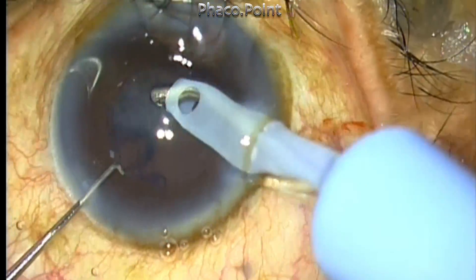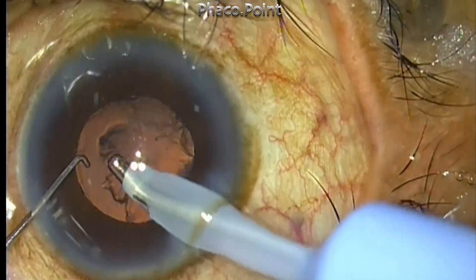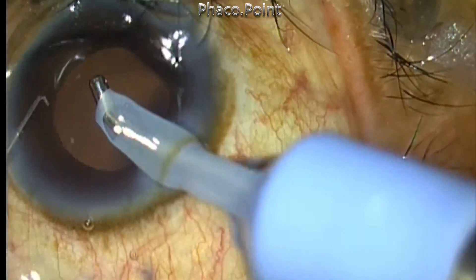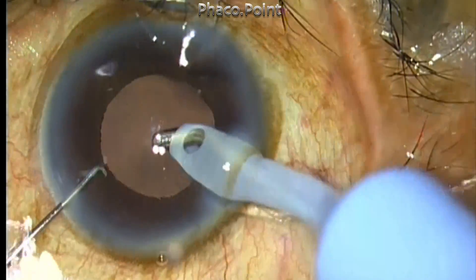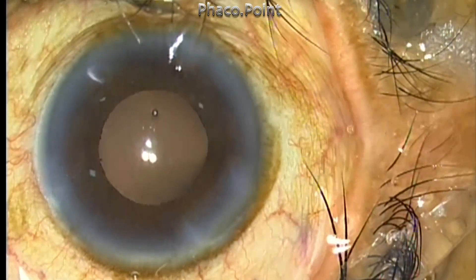During cortical aspiration, by maintaining the aspiration port at the correct plane, it is possible to completely evacuate the cortex without having to push the pupil backwards to enhance visibility. This completes case one, which was performed under topical anesthesia.